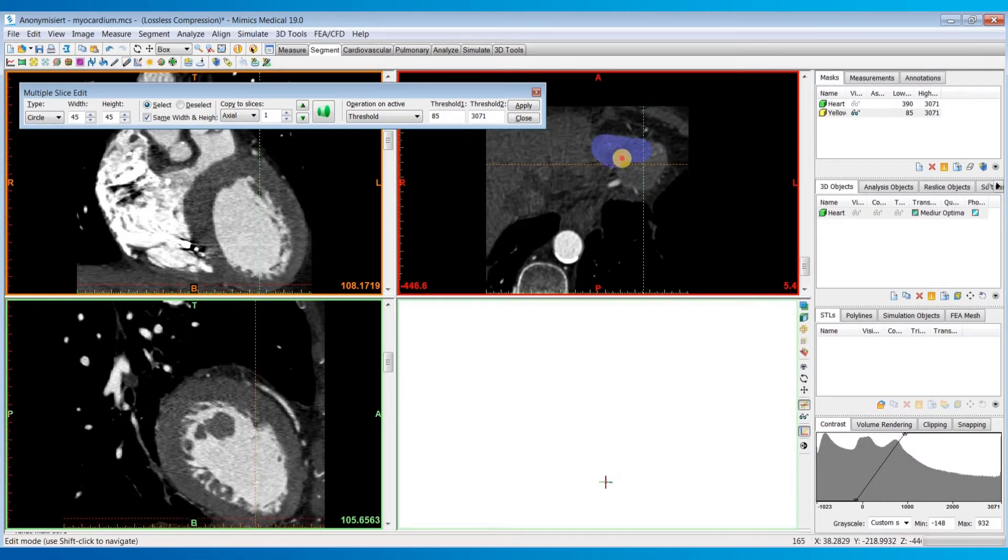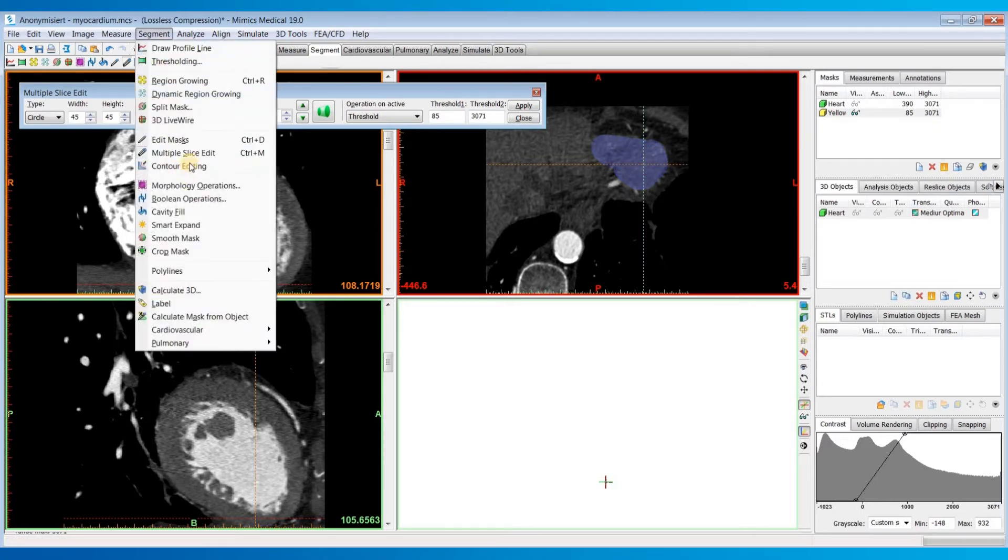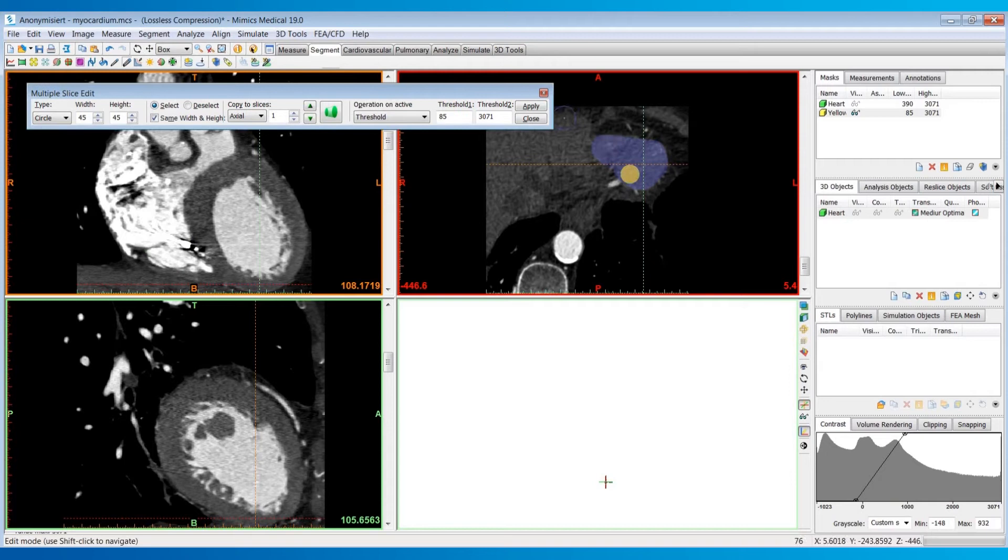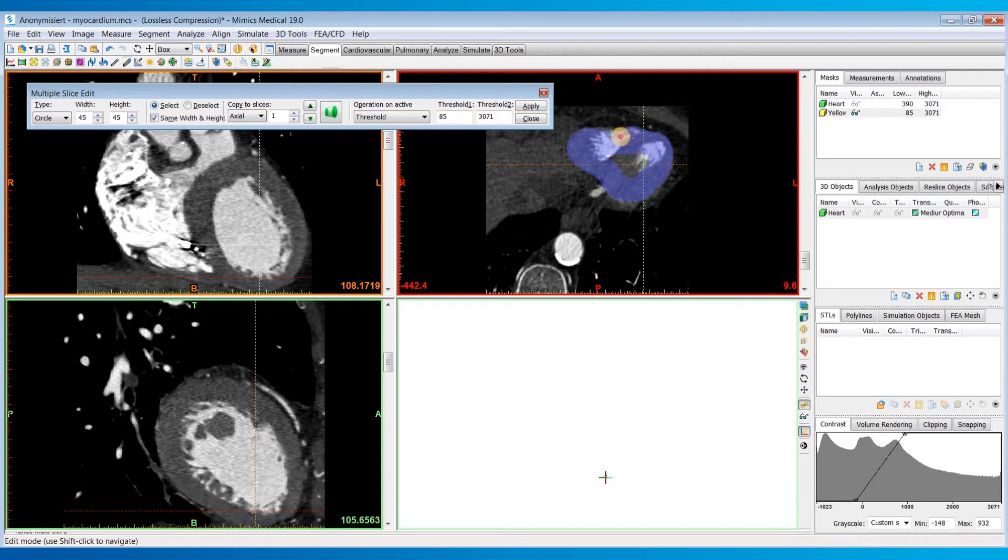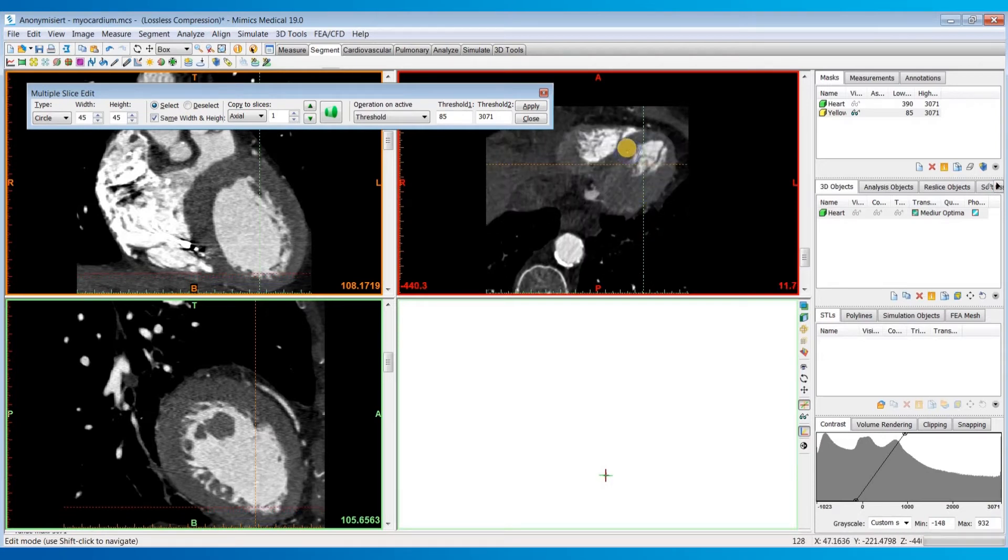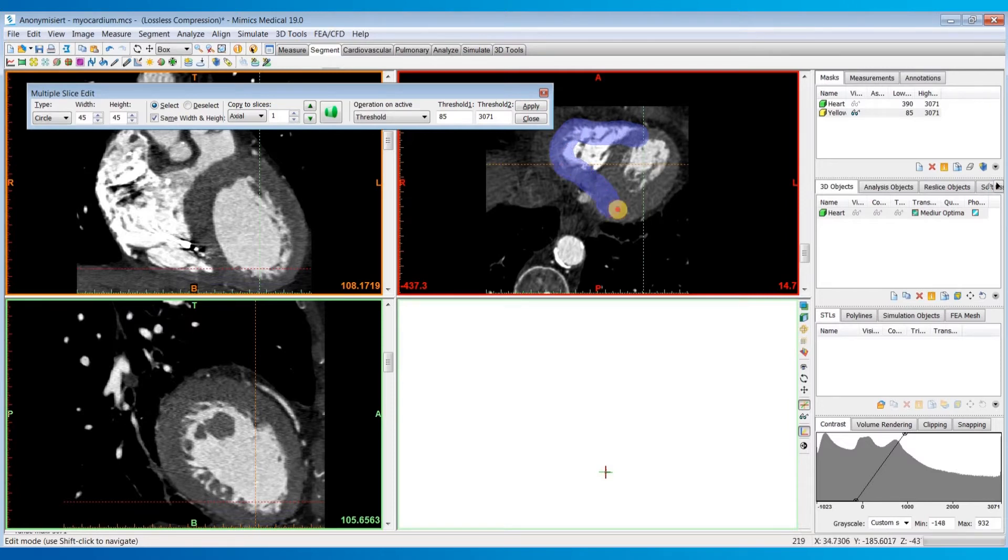I'll hit Ctrl+M to open the multi-slice edit tool. You can also access it from the segment menu. I'm just going to start marking every couple slices, and you don't have to worry about staying perfectly within the boundaries because we will perform a local threshold on this region.